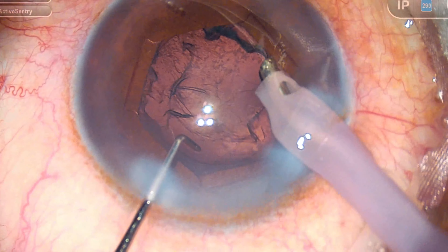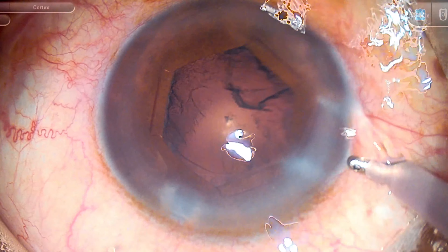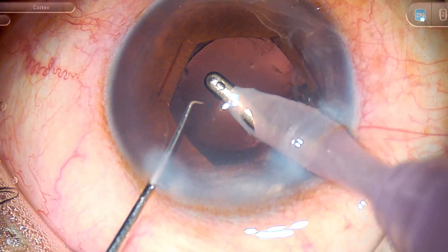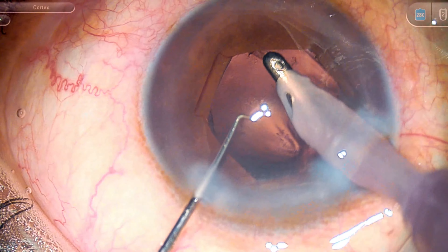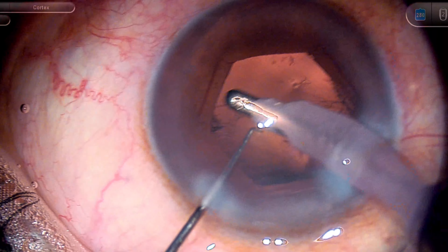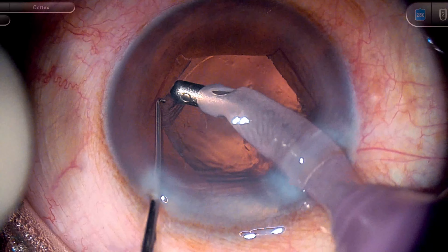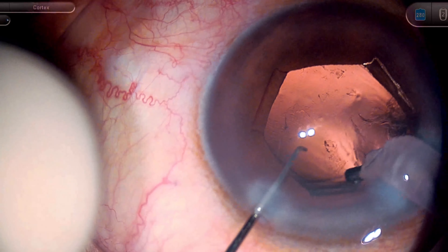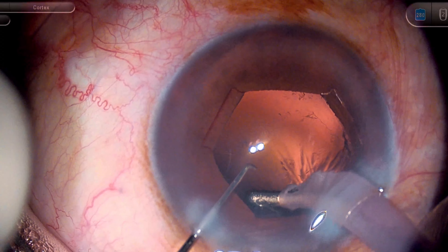The heavy dispersive OVD — Hilucote — helps in maintaining endothelial safety. During cortex removal it is important in small pupil cases to track each part of the bag to make sure cortex is fully out. Mentally make a note of which areas have been cleared and which may still have cortex. You can also move the B-hex ring around using a Sinski hook to check the periphery. It is important to take out most of the cortical fibers — sub-incisional ones I usually approach with low vacuum first, then drag and aspirate.